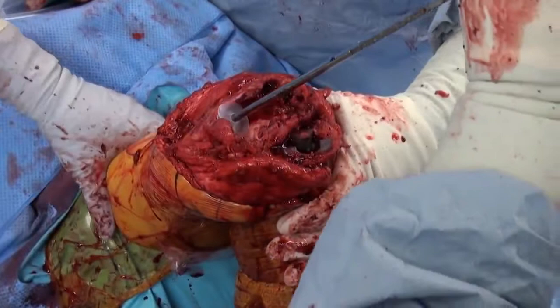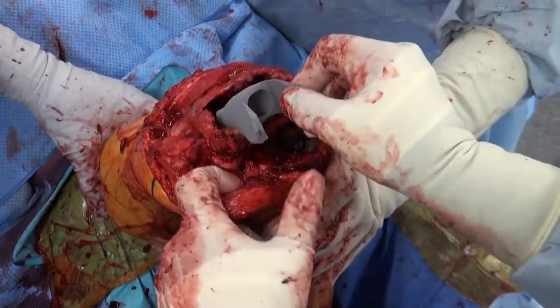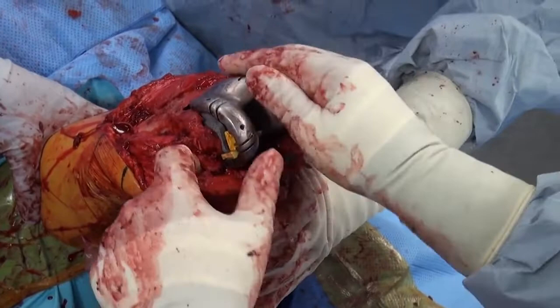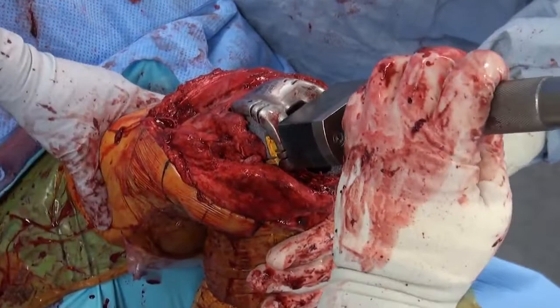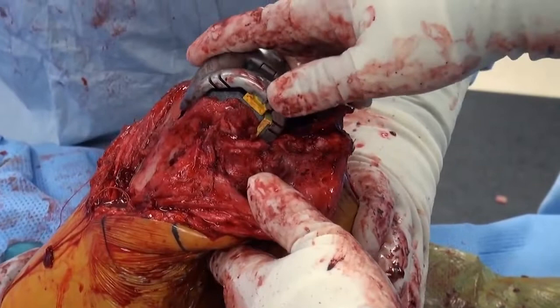The mark on the inserter controls the depth of the plug placement. The real cone is identical in shape to the trial but has a rougher surface, will engage a little bit sooner, and requires impaction to the final level desired. We typically use the actual trial component as the final impactor. This ensures proper position of the femoral component and satisfactory cone placement without encroachment against the real component when it is cemented in place. This shows the final construct, and then cementing proceeds following this of the real component.